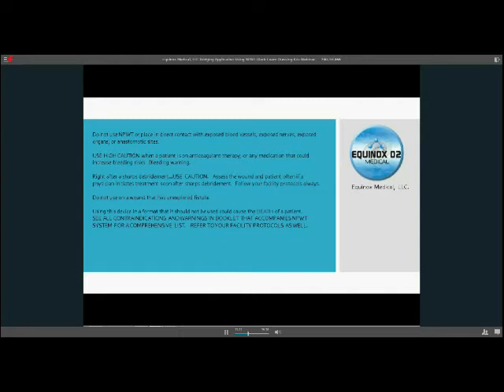You definitely do not want to use it directly on blood vessels, any type of exposed nerves, organs, anastomotic sites, or anything like that. That is something that would be an absolute no. So if you have any questions or, clinical wise, have that checked out before you put something in.